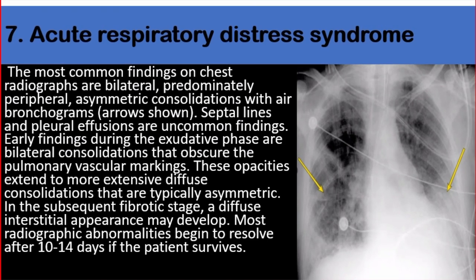Number seven: acute respiratory distress syndrome. The most common findings on chest radiographs are bilateral, predominantly peripheral, asymmetric consolidations with air bronchograms. Septal lines and pleural effusions are uncommon findings. Early findings during the exudative phase are bilateral consolidations that obscure the pulmonary vascular markings. These opacities extend to more extensive diffuse consolidations that are typically asymmetric. In the subsequent fibrotic stage, a diffuse interstitial appearance may develop. Most radiographic abnormalities begin to resolve after 10 to 14 days if the patient survives.